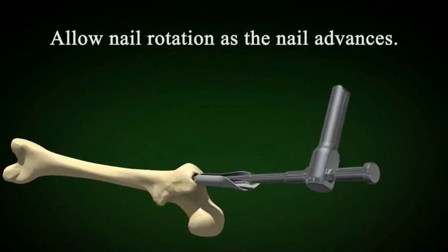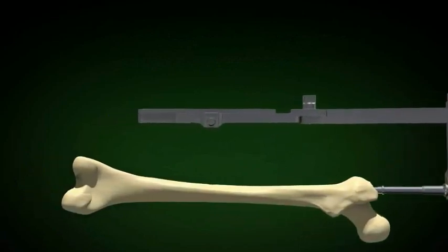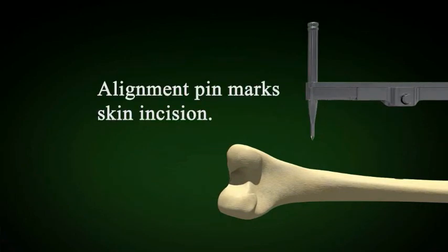It is very important to allow the nail to rotate as it will as the proximal bend enters the greater trochanter. This is a very important maneuver because if you don't do this, you can create a femoral neck fracture.